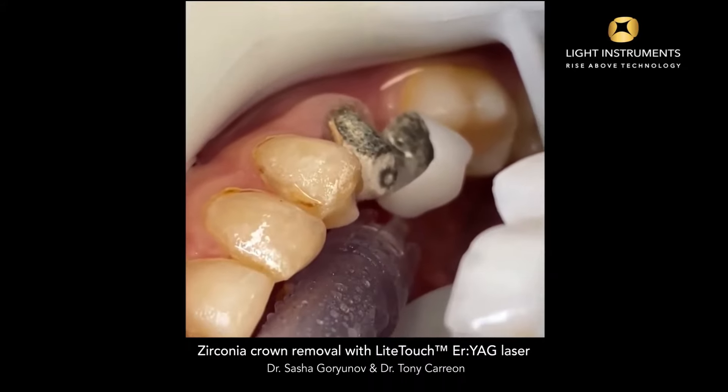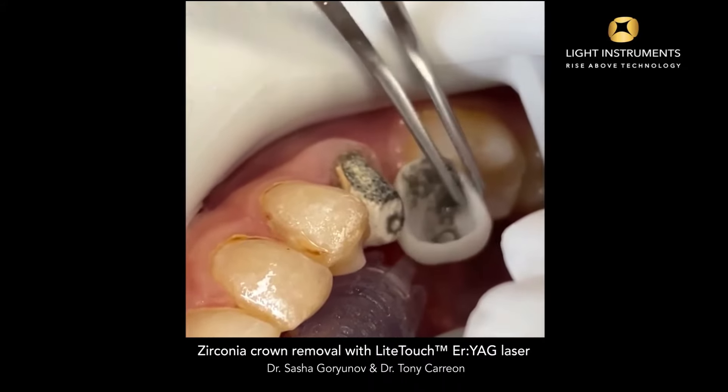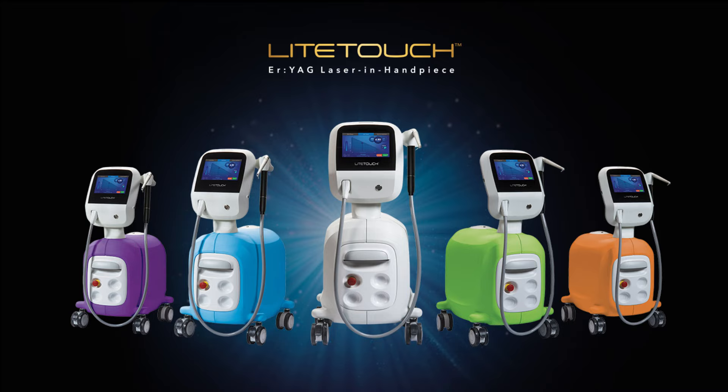And that's how you remove zirconia dental crowns easily and quickly using the Light Touch All Tissue Laser. This cutting-edge technology revolutionizes the crown removal process, ensuring patient comfort and efficient treatment.